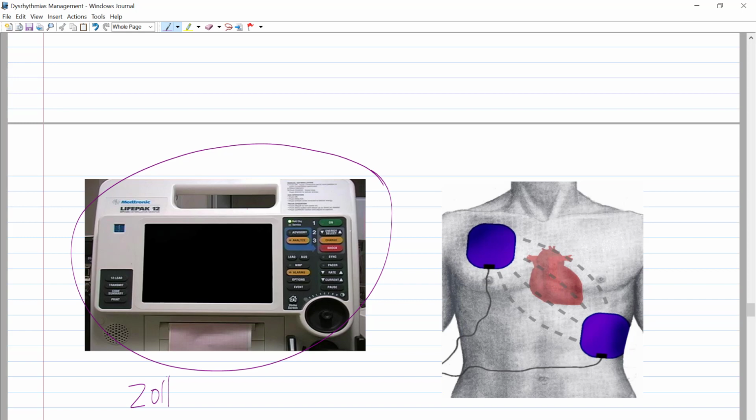So to defib, you want to press energy select. How much? You can start from 200 to 360 joules. Then you charge, make sure no one is touching the patient, check everyone around you, and then shock the patient, and then proceed doing CPR. So as you can see in shocking the patient, this is monophasic. It encapsulates the heart to shock it and restart it.